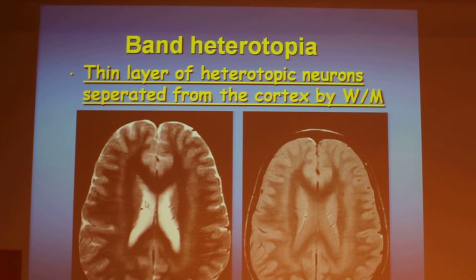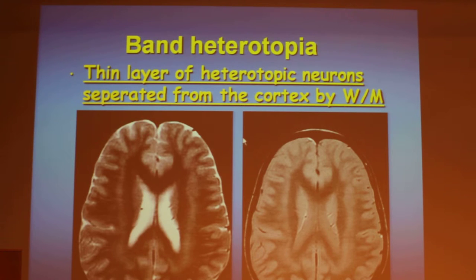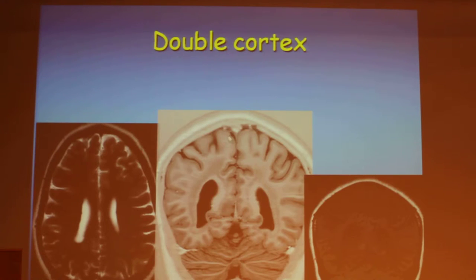So we have alternating gray matter, white matter, gray matter, white matter, and again the cortex — gray matter. So all this band of heterotopic gray matter is the band heterotopia. It is also called the double cortex sign.